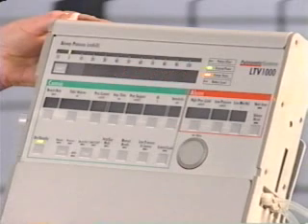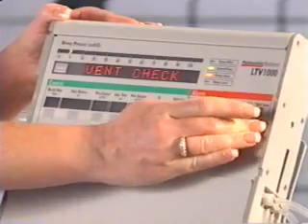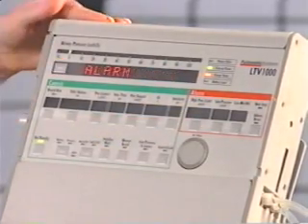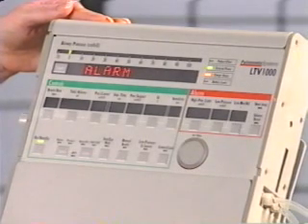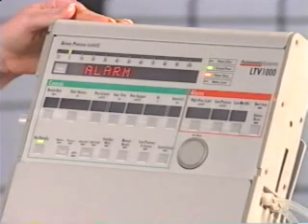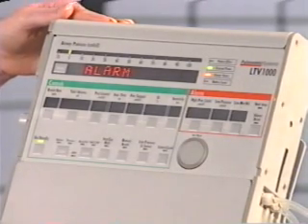Immediately after the POST test, the remove patient message is displayed. This is just to remind you that the patient should not be connected to the ventilator during this test. Press the silence/reset button to clear the remove patient warning. Press the select button to start the ventilator checkout test. The first test, alarm, is now displayed. The alarm test verifies that the alarm is working properly. Press the select button while alarm is displayed. You should hear the audible alarm. To end the alarm test, press the select button again.